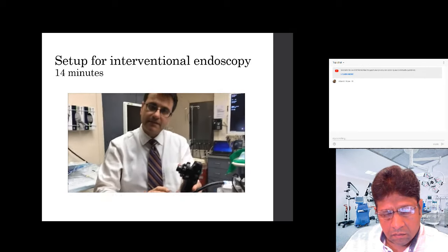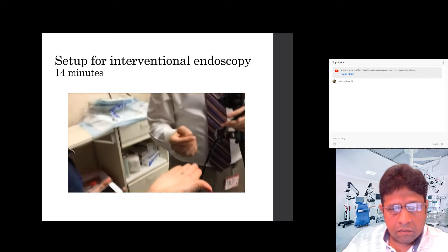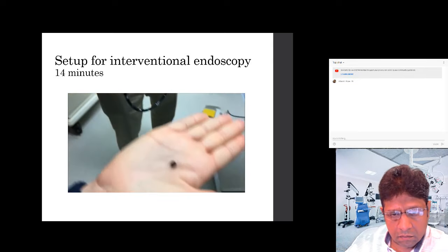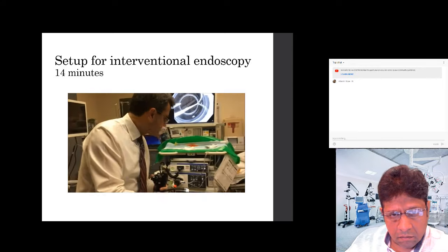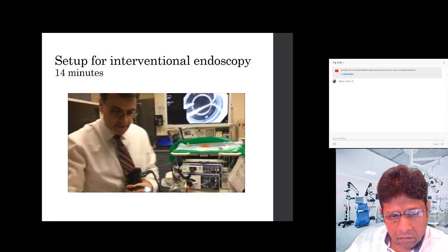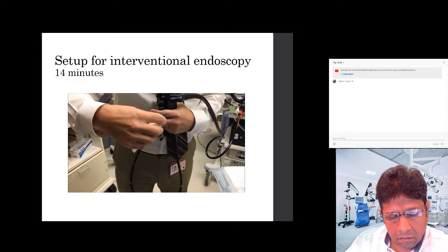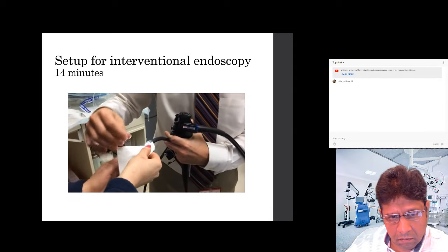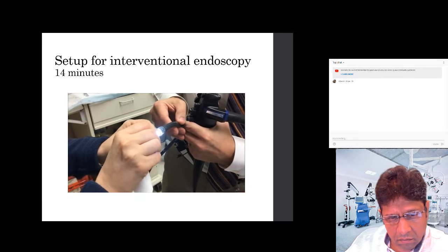You literally just twist the dial, and it shoots a little rubber band on. Oh, yep. And you can see it's pretty small once it's in, but that's going to grab the varix, and it's going to choke it off. But if you put something in, let's say this is the vein. So you suction the vein so that it's in the channel. If I could just ask you to hold that there. Make sure it's in there, because the job of the GI guy is to actually suction it in.